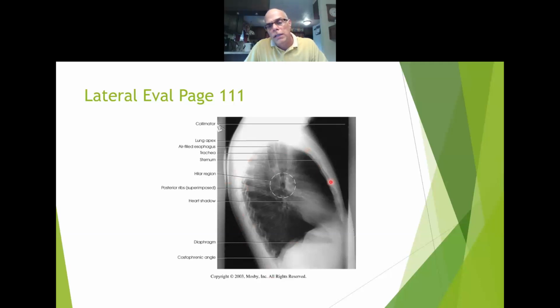And again, you want that sternum completely free. You don't want any lung filled over it. It's really a beautiful lateral. The sternum is in clean and it's in profile. You can see the sections of it. See right there, the manubrium. See that? There's a xiphoid.